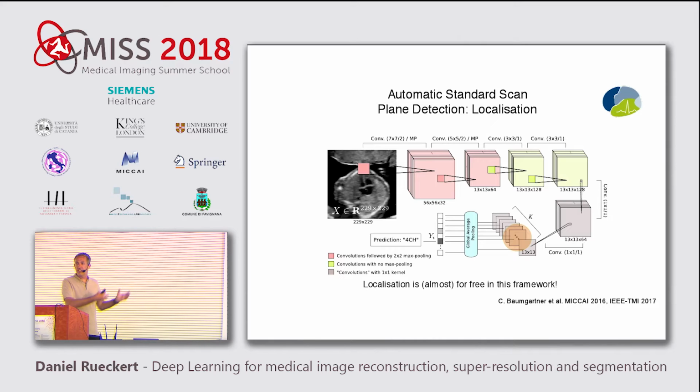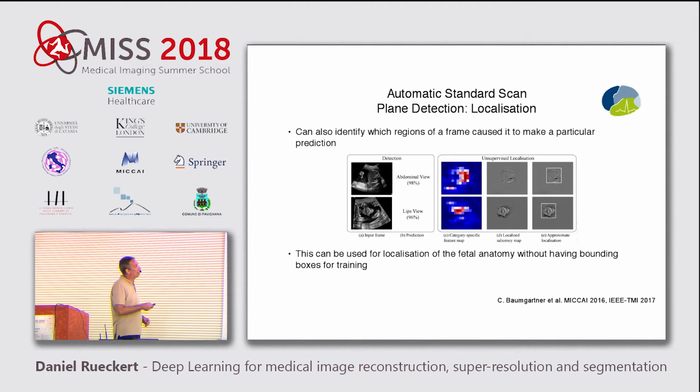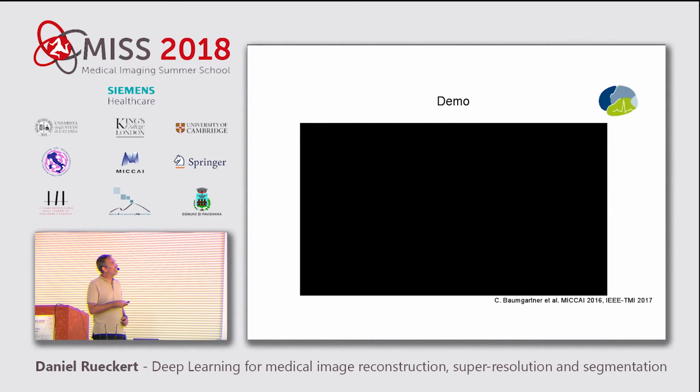So effectively, this is sort of the object detection equivalent to computer vision. Here you see, for example, that if it's a spine view, the saliency map is a spine. Here, a 4-chamber view of the heart. You see the beating of the heart in the 4 chambers. And then if you threshold this feature map, which you will see in a moment, here's a femur, the bone in your leg, you can see that you can detect the object with very simple thresholding, correct? And you can still do this at very high frame rates. You can still do this in real time.